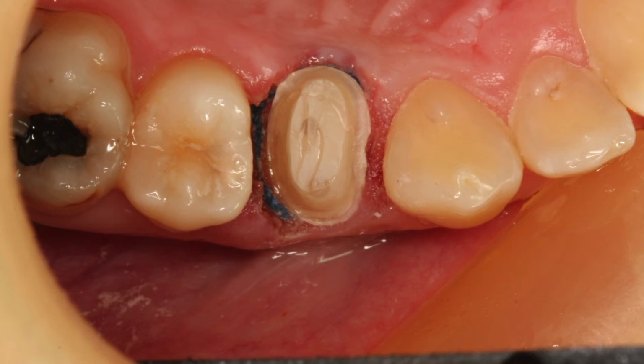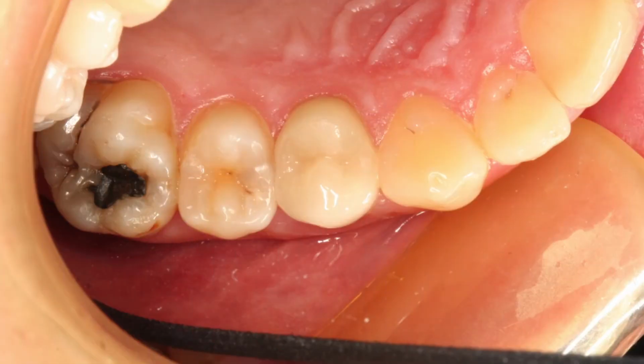Right, but again, now when we get this, either as a digital scan from the dentist or a polyvinyl impression that we pour up and then scan, we have no idea whether or not that's a virgin tooth, we don't know that it's built up, we don't know that it has a post in it, so we're able to treat it the best way that we can, and you got a really nice result with whatever that crown is. Do you remember if that's Emax? I think that's probably one of the first Emax I did.